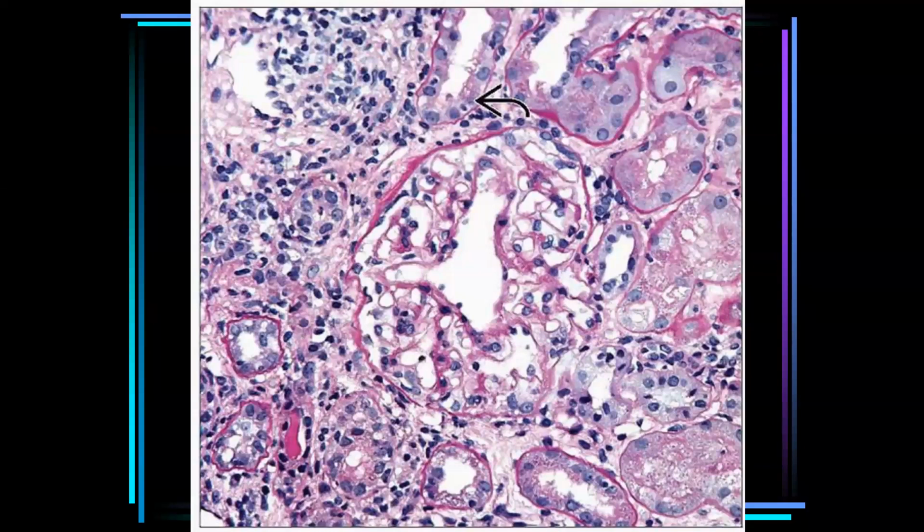But if we are going to use pathological findings to discriminate acute from chronic, it is mainly considering the presence of edema in the acute and the presence of fibrosis in the chronic situation. But the type of infiltrate, for example, the presence of neutrophils or eosinophils or lymphocytes or monocytes, doesn't differentiate. But the picture present in front of us includes tubulointerstitial nephritis.